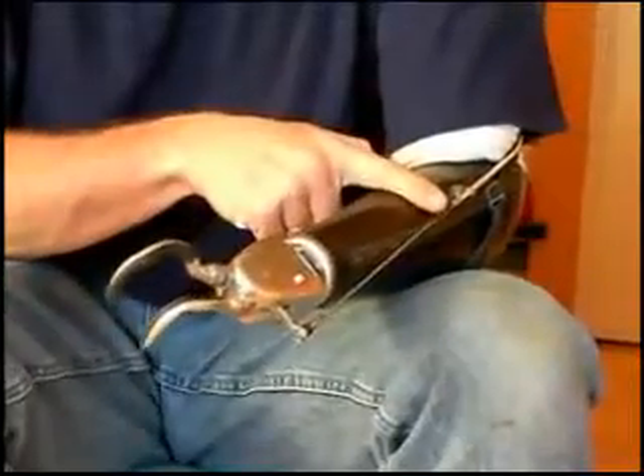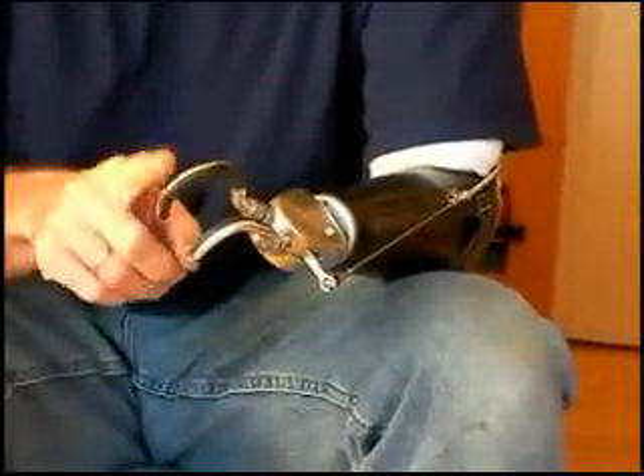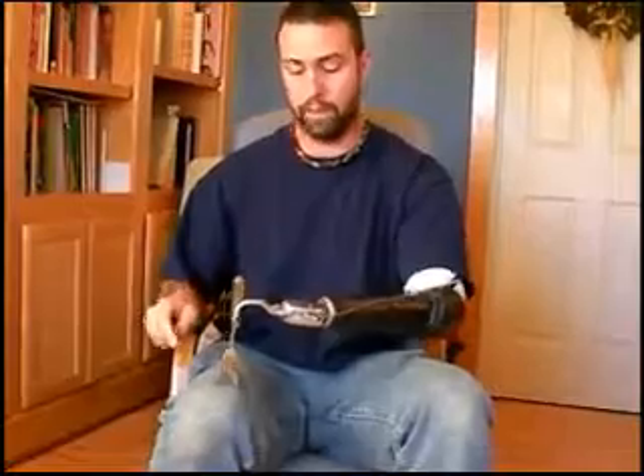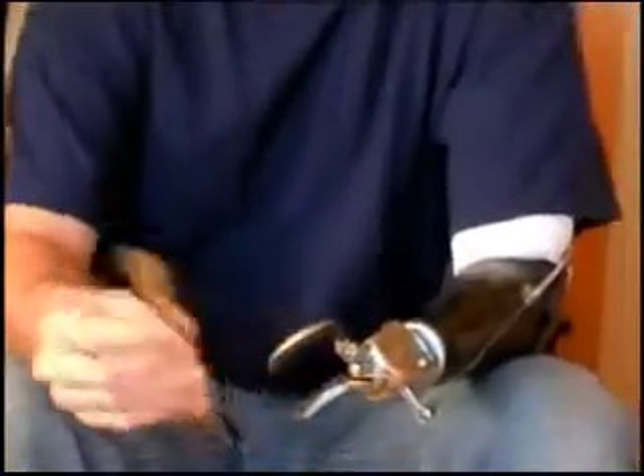The other nice thing is that when it's voluntary closing, you can apply as much force as you want to hold on to something. For instance, if I'm going to use a knife and fork to eat with, I typically use the fork and hold it first. I can apply a lot of force to keep it locked — this fork is very tight in here. I don't have to worry about it sliding out on me. Of course, once you tighten it down this much, you need to apply an equal amount of force to get it to release and open up again.